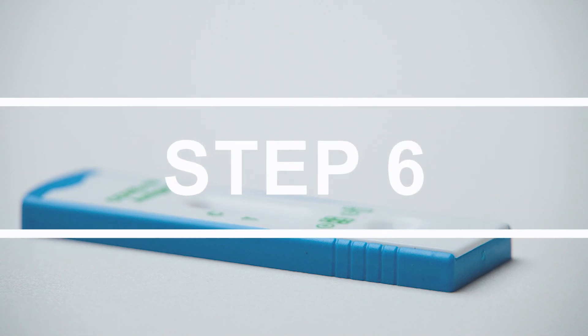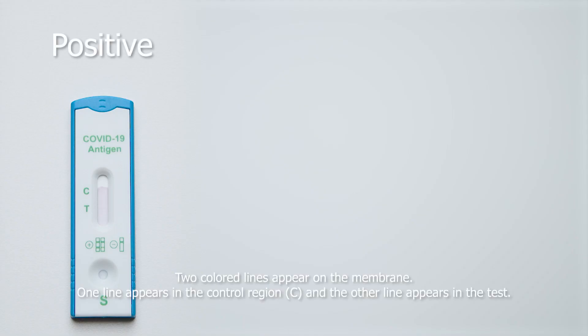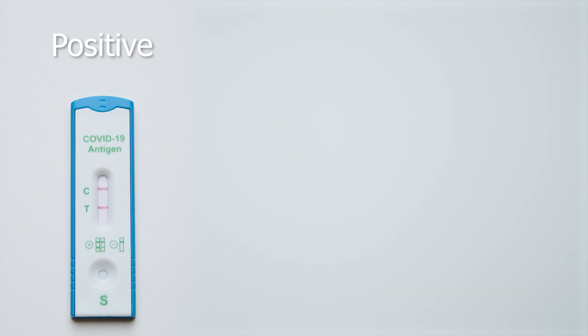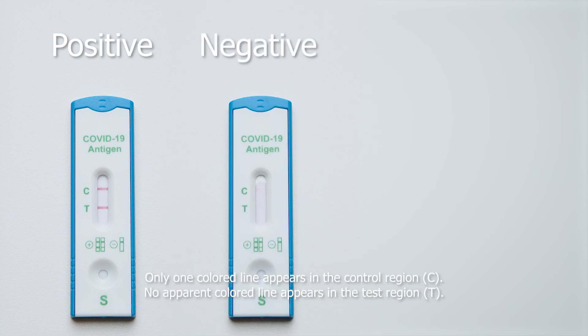Step 6. Read the result. Positive: two colored lines appear on the membrane — one line in the control region and the other line in the test region. Negative: only one colored line appears in the control region, and no apparent colored line appears in the test region.